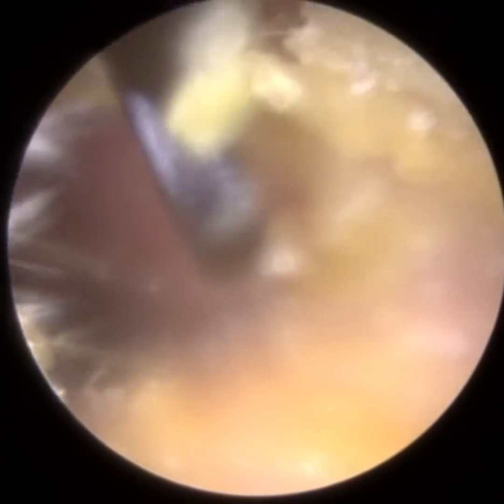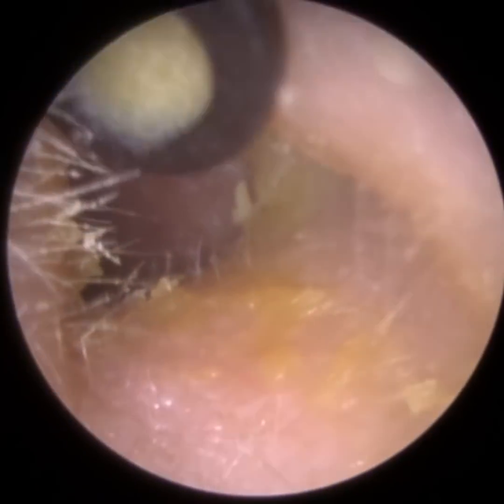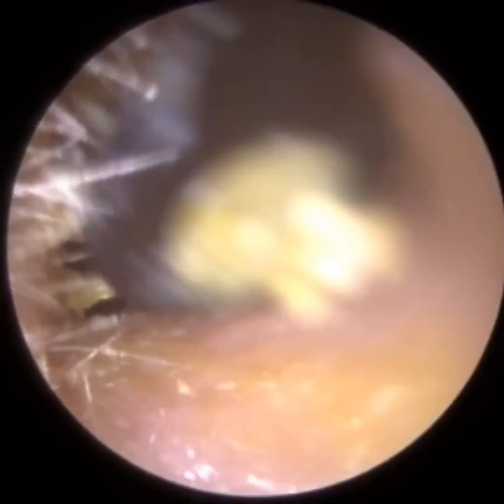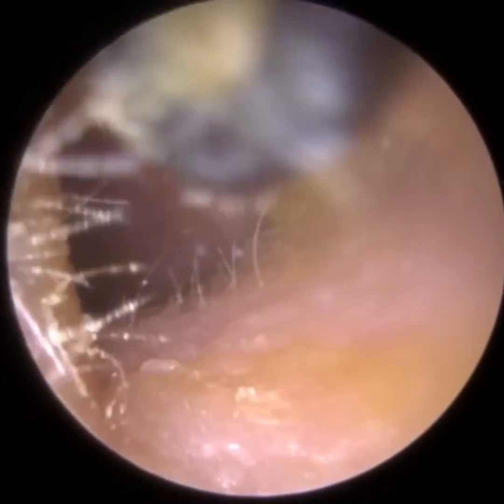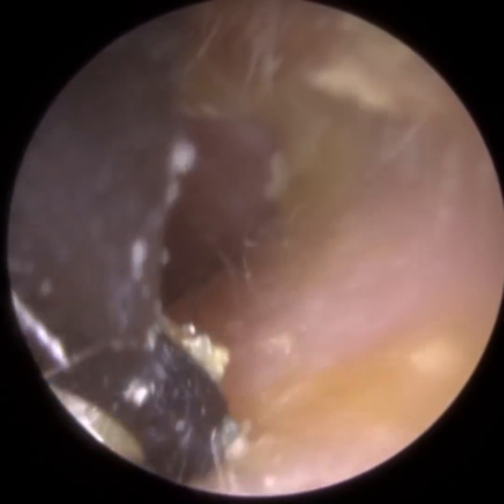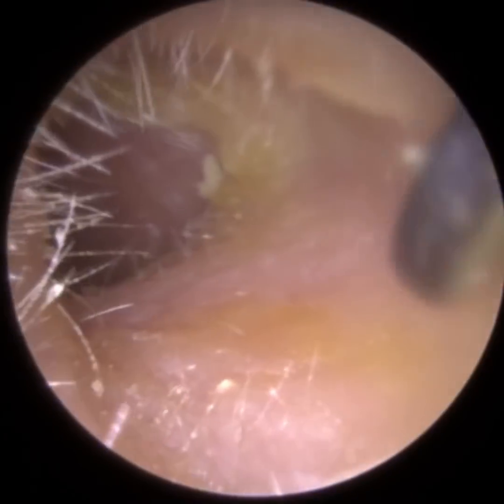I just want to mop up as much of this soft dead skin, debris that's accumulating on the ear canal. I'm using a Jobson horn to do this. It's because of the consistency, it's a bit sticky and gooey. You can tell just when I'm scooping it. Jobson horn's a better tool to remove this than suction. And because we're on the cartilaginous portion here, we can apply a bit of pressure, so it's not going to be uncomfortable for the patient.